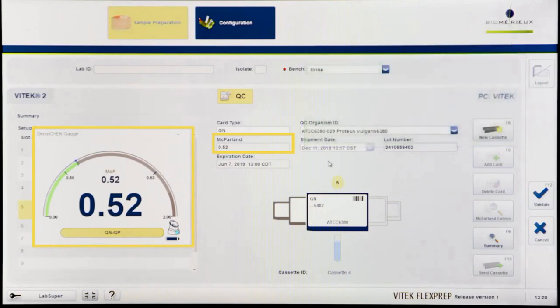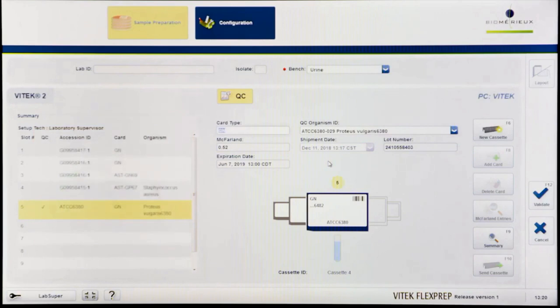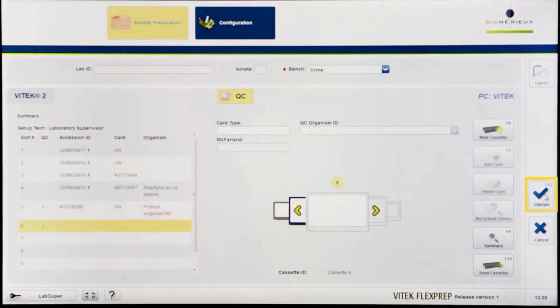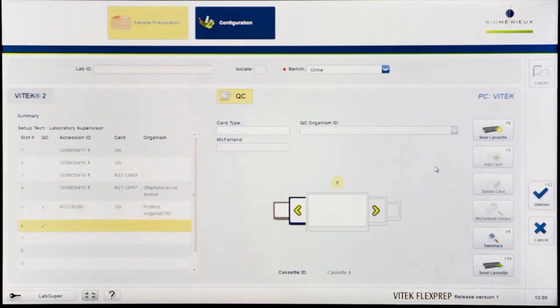Make AST dilutions if needed. Confirm all the details for the isolate are correct and then click Validate or press F12 to save the information and to advance to the next slot to begin setting up cards for the next isolate.